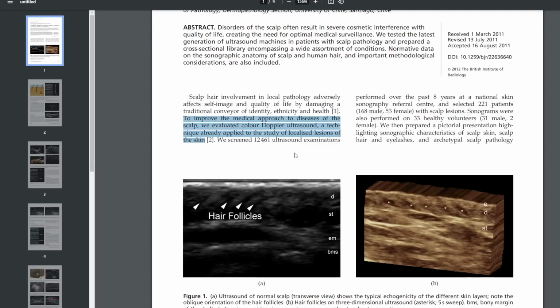And the reason for this is that every time you do a scalp biopsy, the area that is excised results in a scar, just a small scar, but those follicles are permanently lost. However, if we had a much less invasive, barely invasive way of viewing the scalp structures, the hair follicle structures, using sonography could be a really good solution.